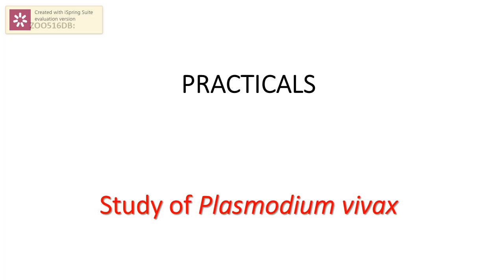Hello dear students, here I am going to discuss the microscopic study of Plasmodium vivax. As you know, there are different species of Plasmodium which cause the disease malaria. Plasmodium vivax is a protozoan parasite and a human pathogen.